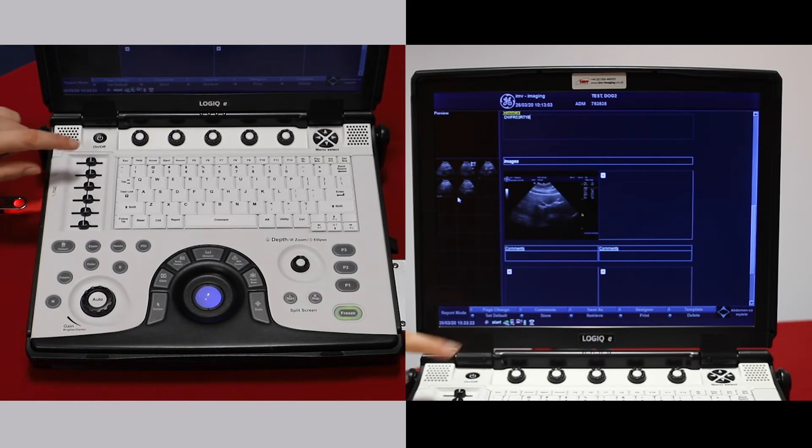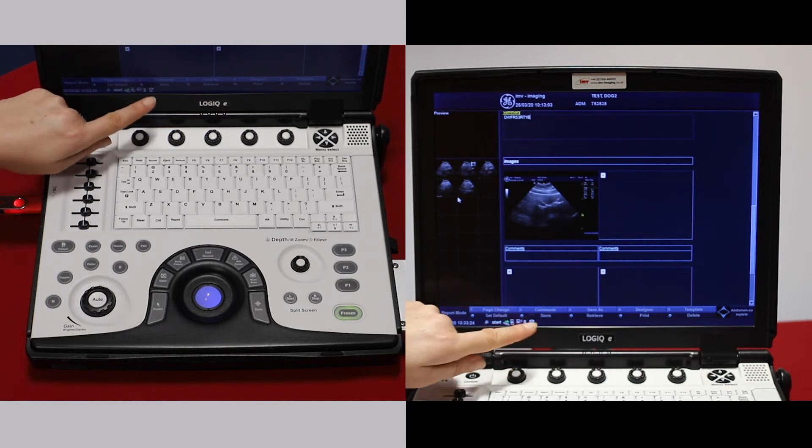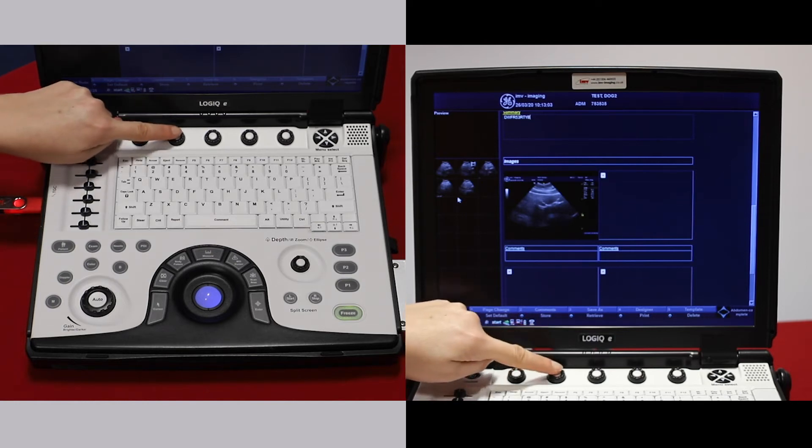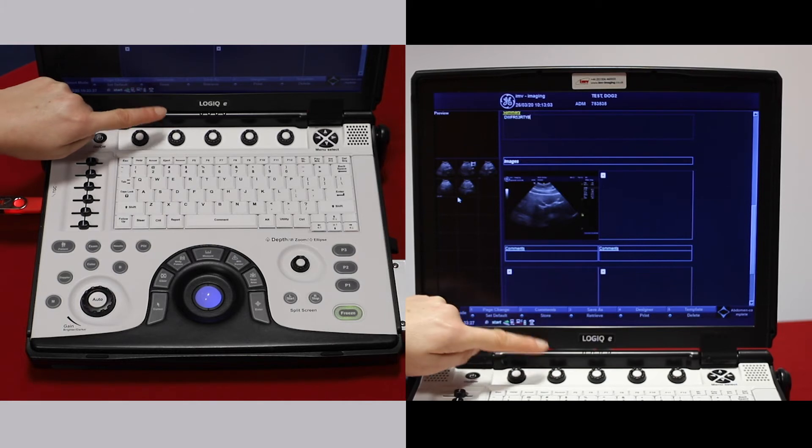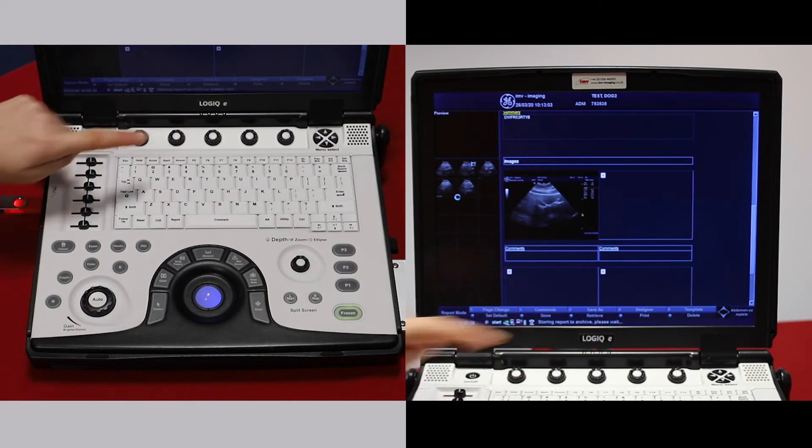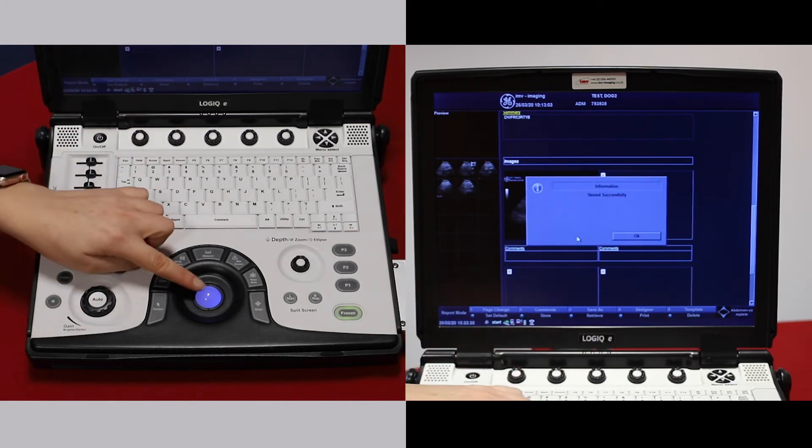Once you've made your report, press this soft key so that it will store to the hard drive and it's stored successfully.